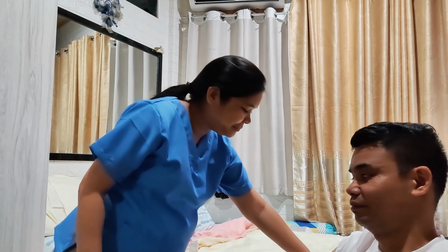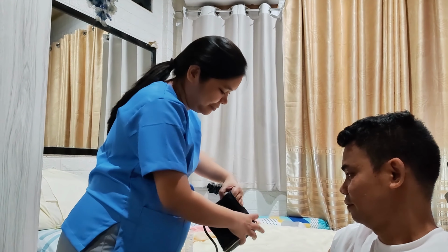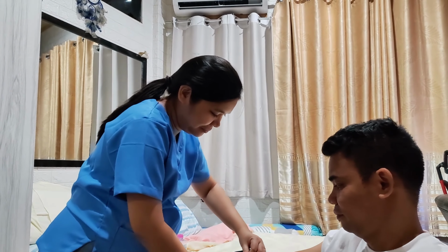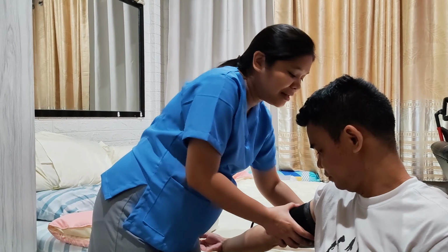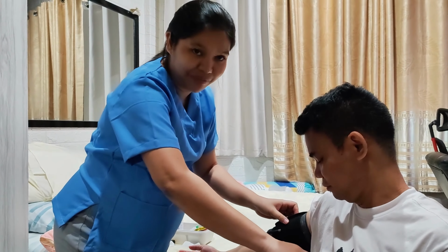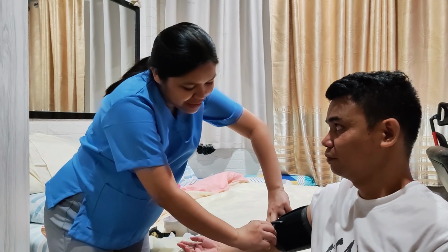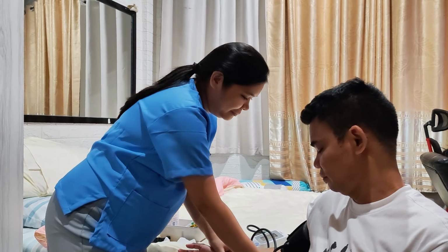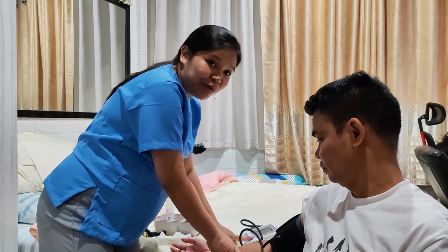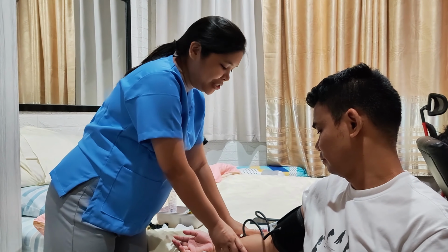Now I am going to take the blood pressure of the patient. Ensure that the cuff is at heart level and 2 finger breadths above the arm fold. I'm going to turn on now the sphygmomanometer to measure the blood pressure of the patient.